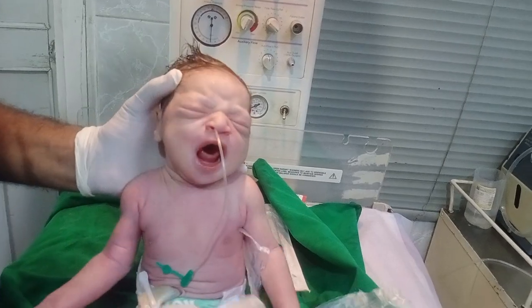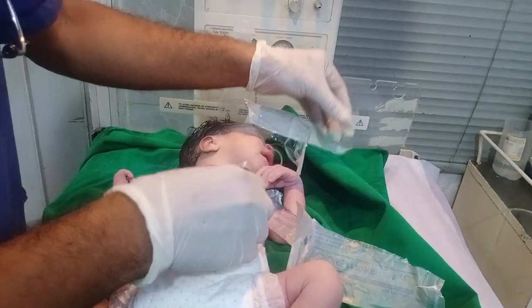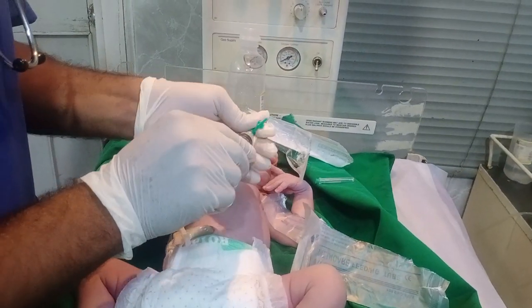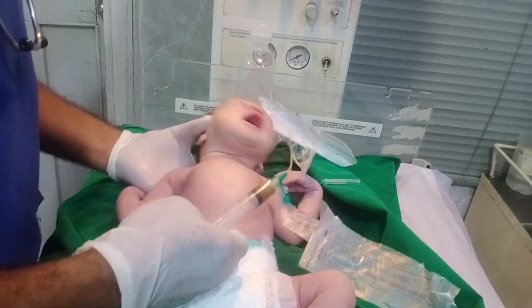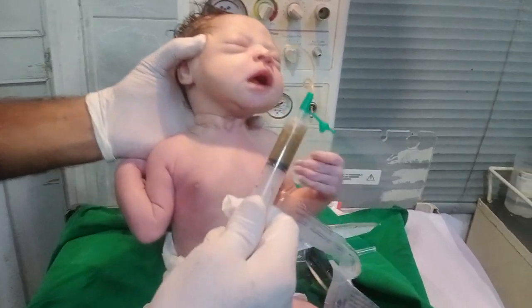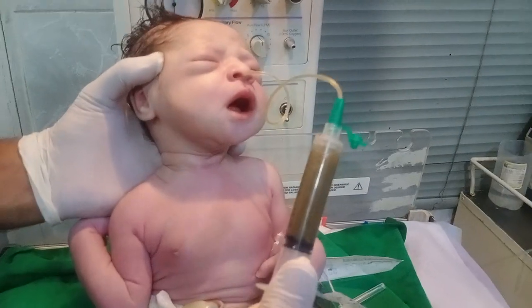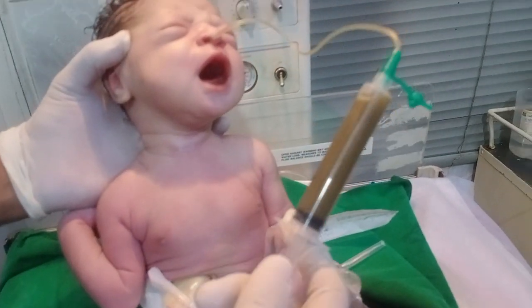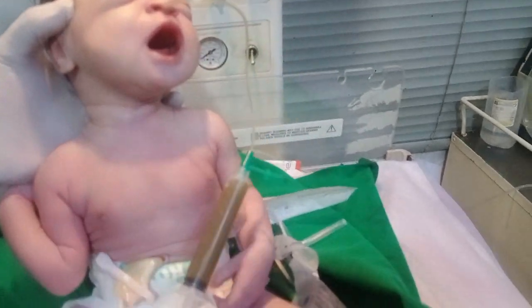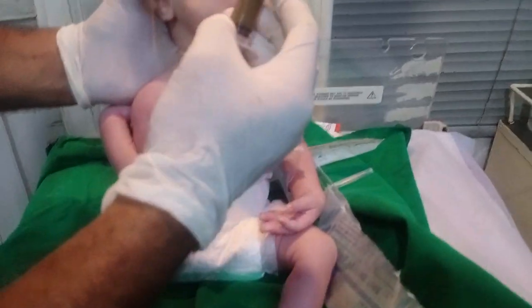We are using the NG method for suction. Look at that — there is a lot of abnormal secretion coming out. This is the meconium. You can see all the toxic material — it's a very large quantity being removed.